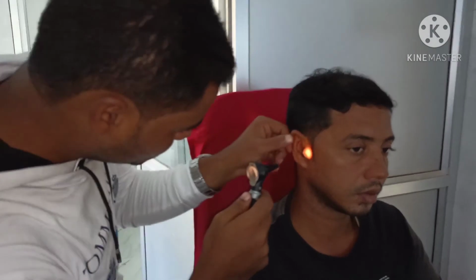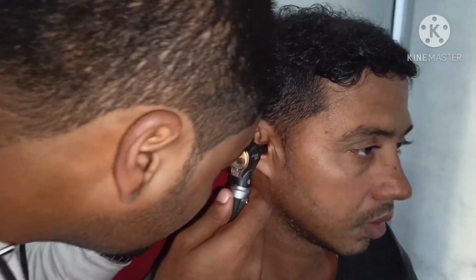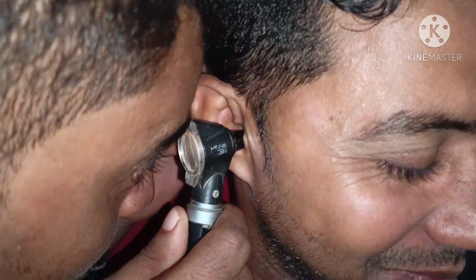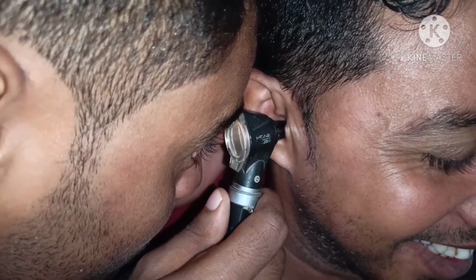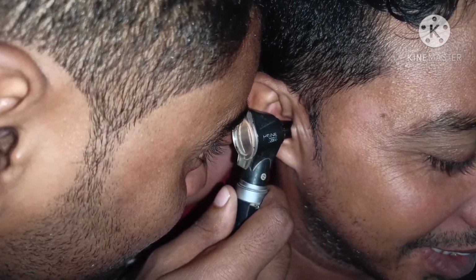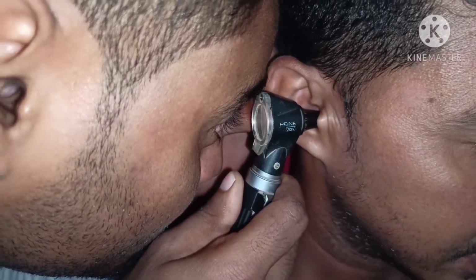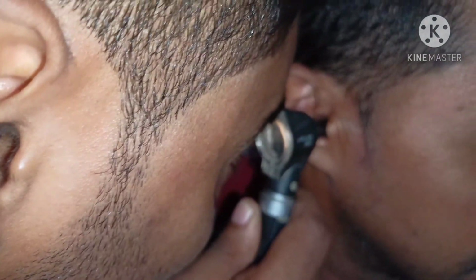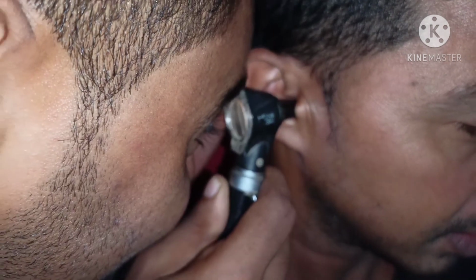Now examine the ear with the otoscope. Slightly move the pinna outward, backward, and upward to straighten the ear canal. Examine closely if there is any cerumen present, redness of the skin, or a foreign body. Note the color of the eardrum. Perform the same with both ears.